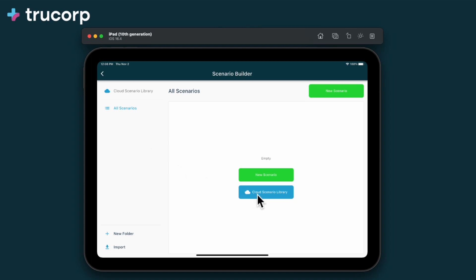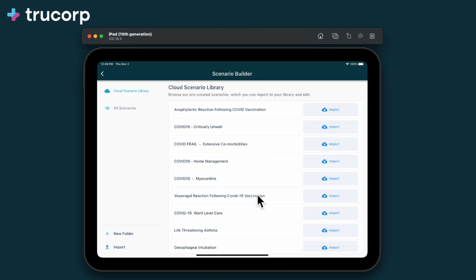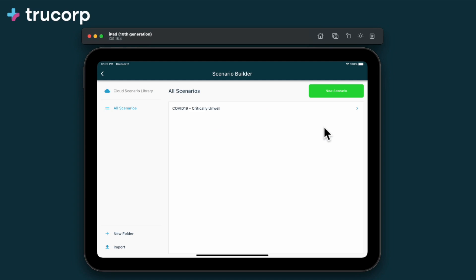Within the Cloud Scenario library you can find some preset scenarios to get you started. Click Import, and the scenario is imported to your personal library.